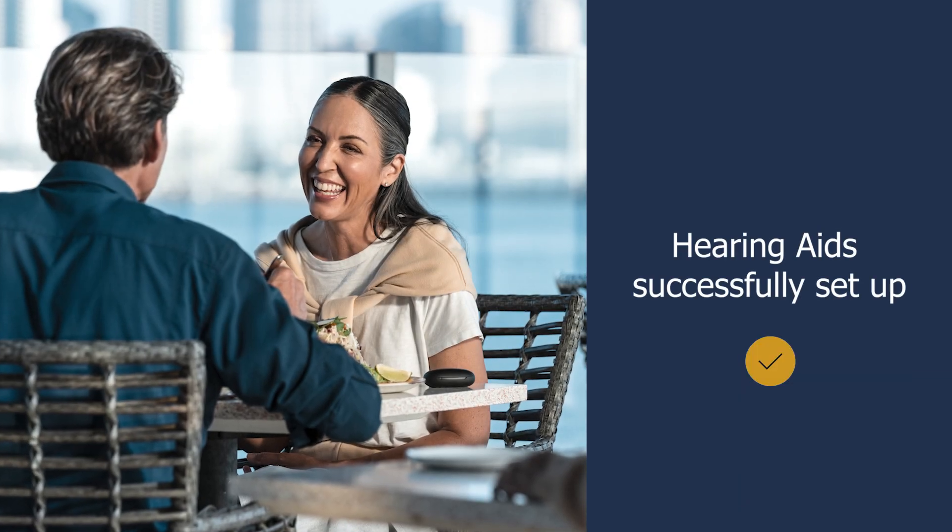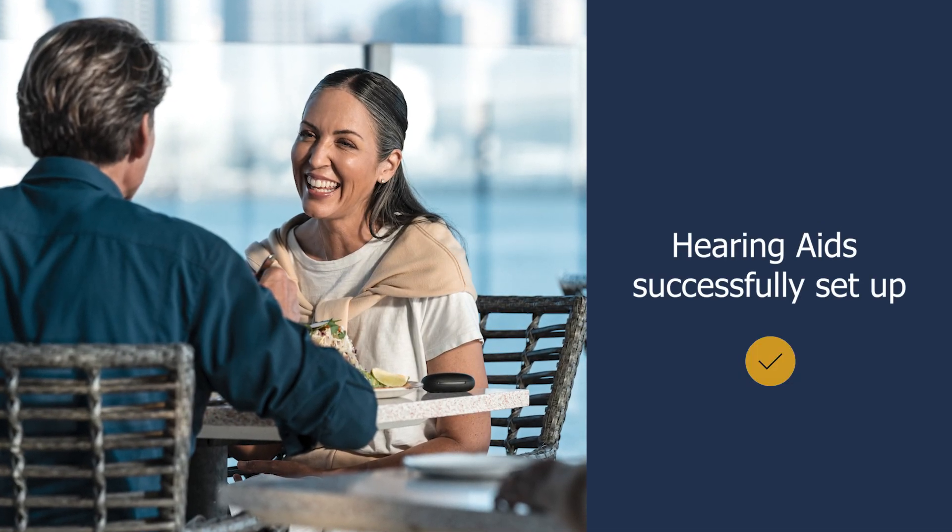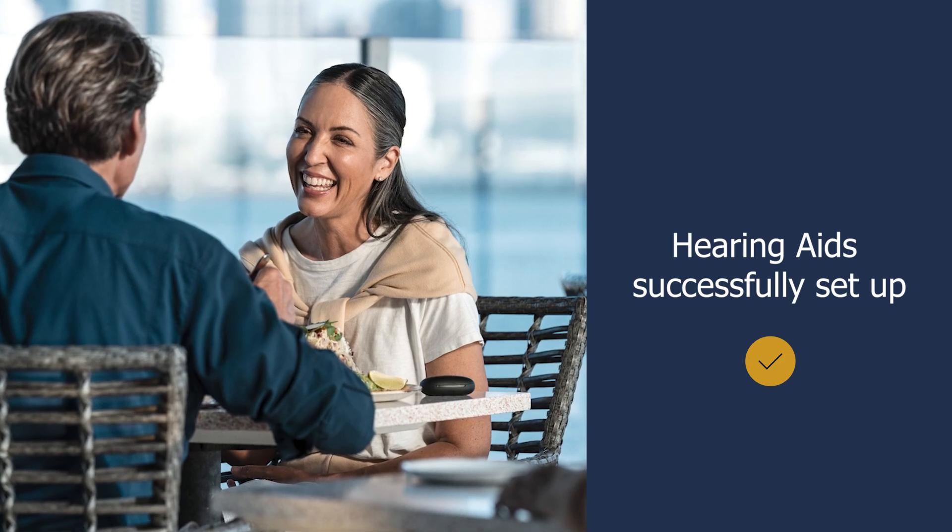Congratulations! You have successfully set up your hearing aids. You are now ready to start using them and further fine tune them with the Sony Hearing Control app if needed.